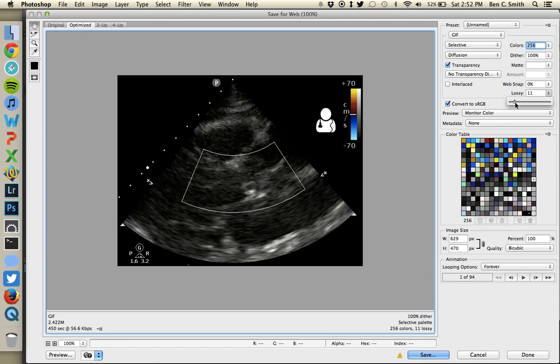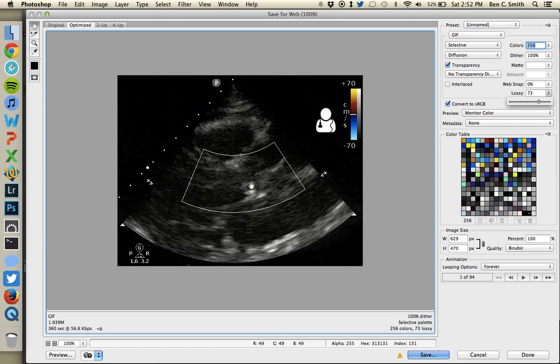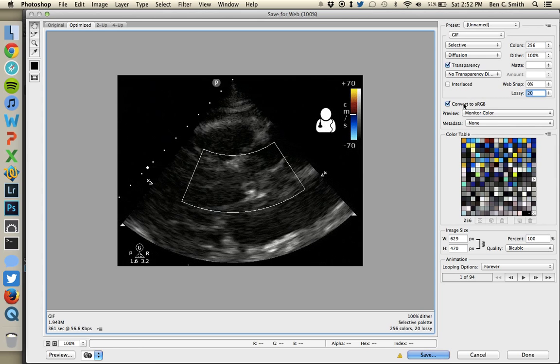Lossiness describes the compression the GIF uses. GIF compression is not nearly as good as JPEG or PNG compression, and if you push lossiness past 50%, the image gets really grainy really quickly. I usually don't go above 10 to 20% on lossiness. Leave the color space boxes at default — convert to sRGB and use monitor color. For metadata, you want to select None so no HIPAA information gets embedded in the output image.